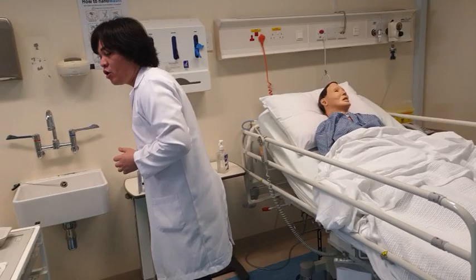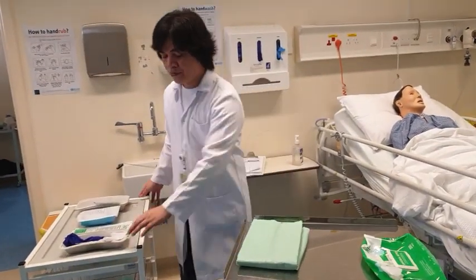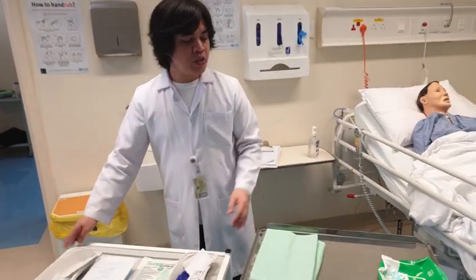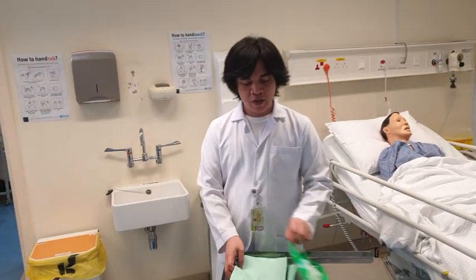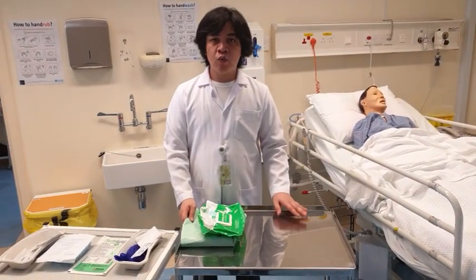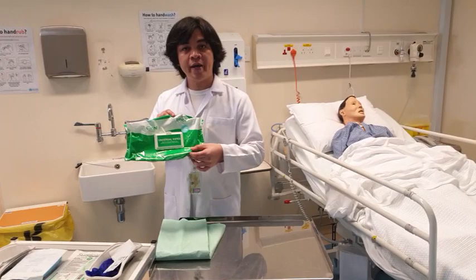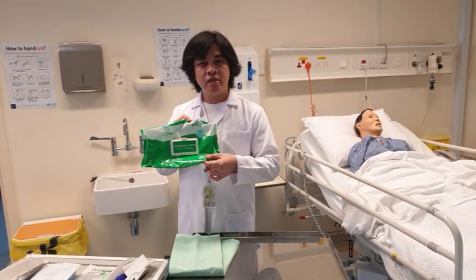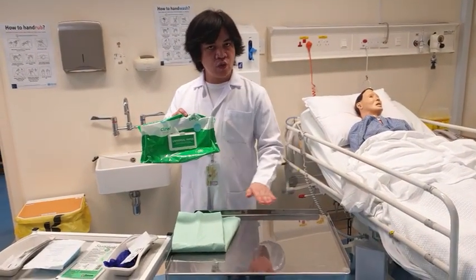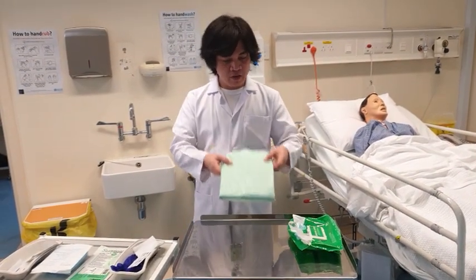So at this point, we're going to prepare the materials that we're going to use. You would see that we have a trolley. This one, the metal table. We call this one a trolley. And it is where we're going to prepare our materials. And we also have wipes. These wipes are used to disinfect the trolley that we're going to use. We also have Inco pad or Inco sheet.